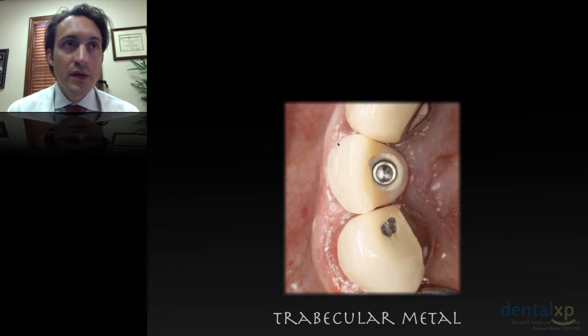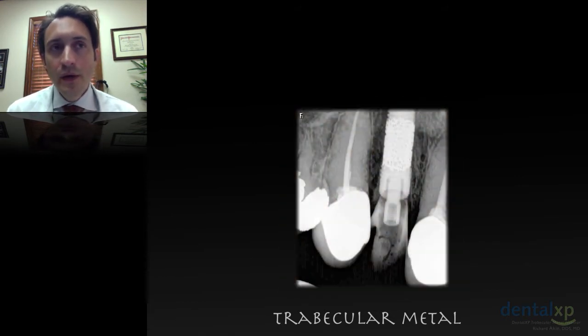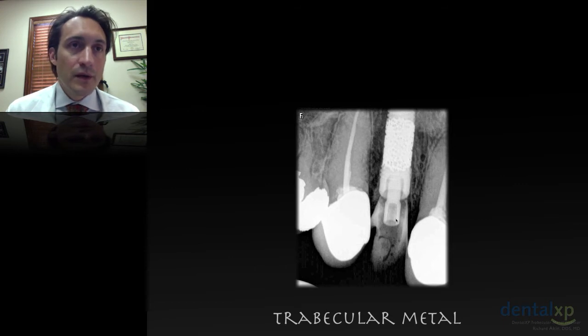Most of the work goes into making sure that we have nice facial anatomy, gingival support, and polish. When we take a final radiograph of this, you can notice the trabeculation of this implant, the trabecular pattern of the implant. You can see the apical threads, the crestal threads, and this is the provisional in place. In this case, the implant was placed approximately 3.5 millimeters subgingival, approximately at the level of the buccal plate.